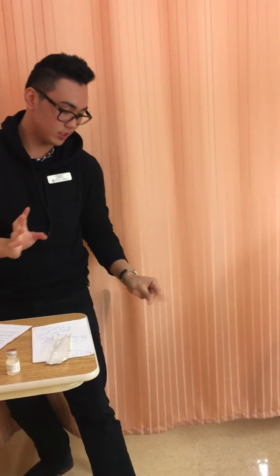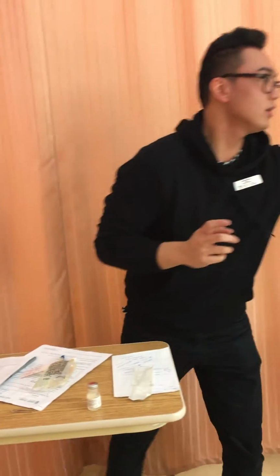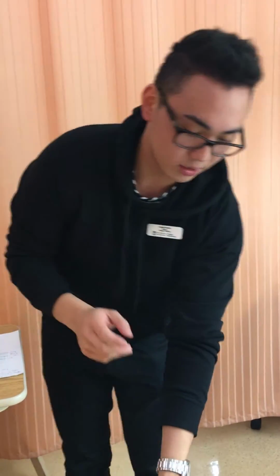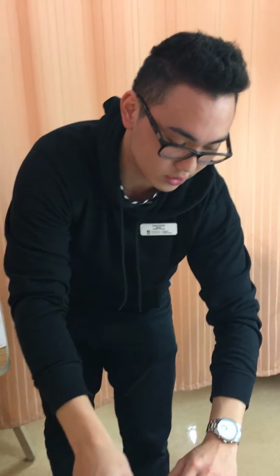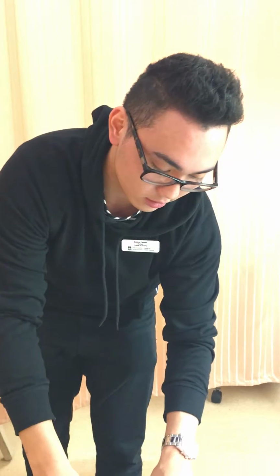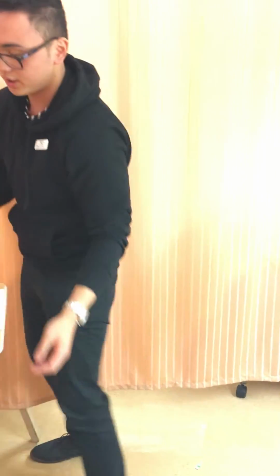No? Okay, and now we will do a quick safety check, making sure that there's no spills on the floor and that all the tubing is properly placed. Okay. And while we're here, we could also check the IV side to make sure that there's no inflammation, any redness, or if the patient has any pain, and you can ask about that. Are you in any pain? Okay, no, so IV side looks pretty good.